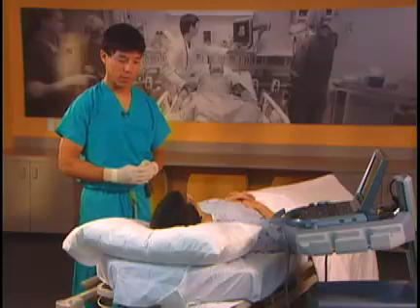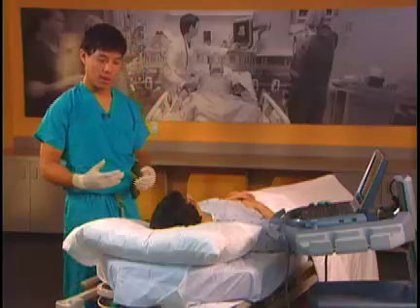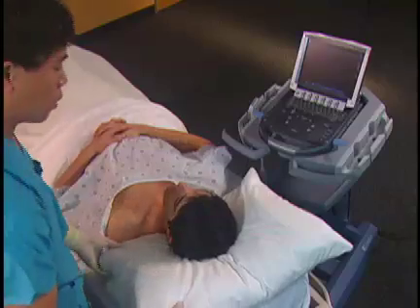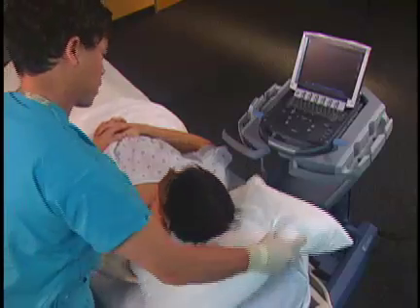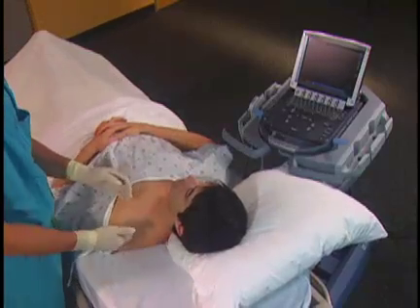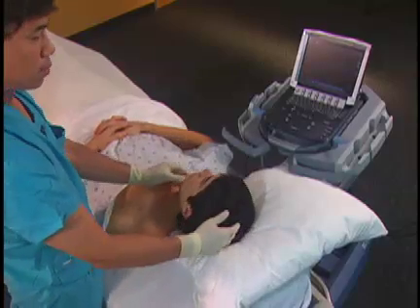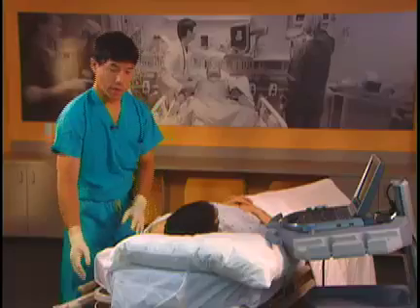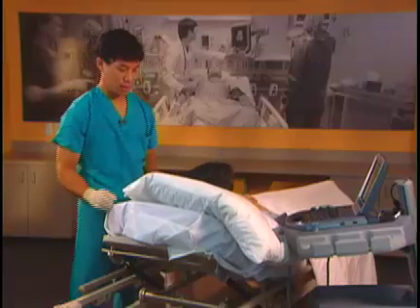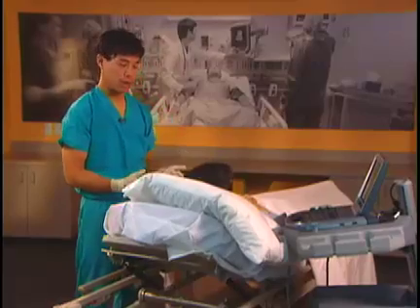To start a supraclavicular block, it's very important to position the patient properly. We move the pillow all the way over to the side so our hands have plenty of room to come from the posterior side of the patient. We also turn the patient's head away from the site to be blocked, then elevate the head of the bed 30 to 45 degrees, giving us a comfortable hand position while we do the block.